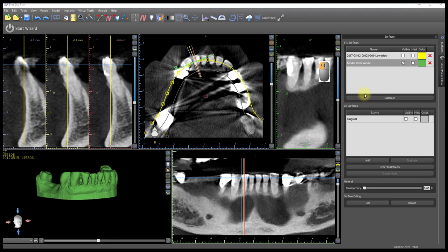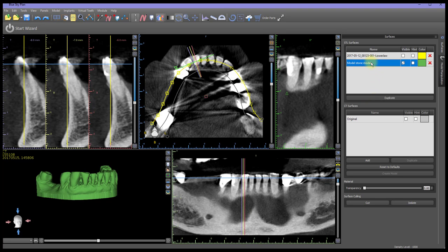In the Surfaces panel, left-click on the model name to highlight it, then left-click on the Cut button at the bottom of the panel.